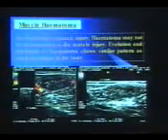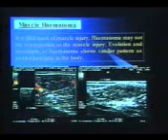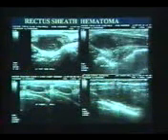It is like an iceberg, the tip of the iceberg, where it looks like only the tip is seen, but the hematoma is so big, covering deep, which you cannot palpate clinically. So this is the story with hematoma, where ultrasound can help you.